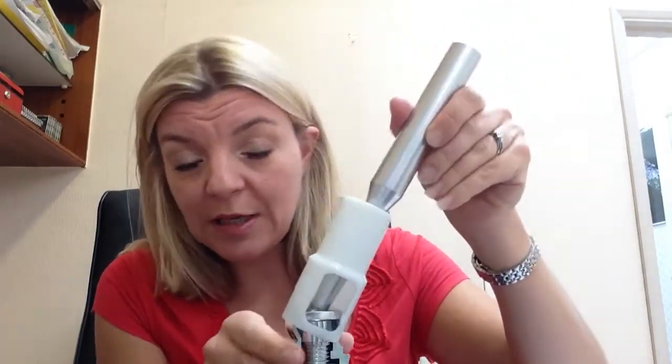The screw is screwed in at any angle. Here you can see there's a hole in the front of this to show you how easy it is, even at quite a steep angle. This is because of the special faceted edge of the screwdriver.